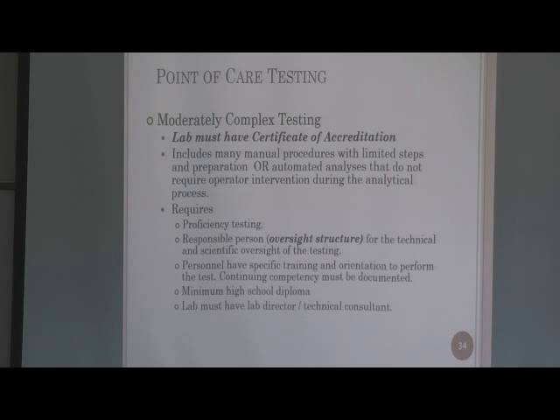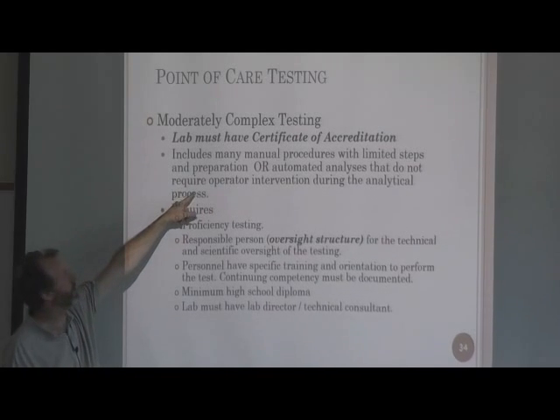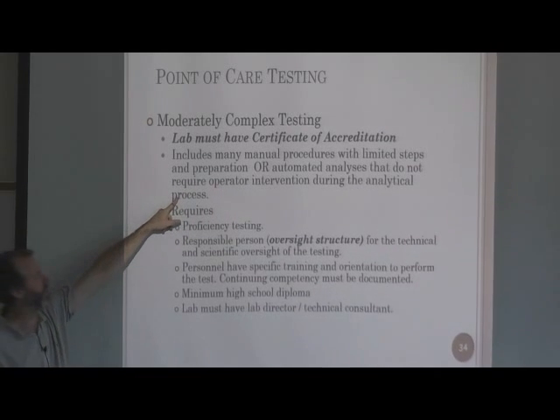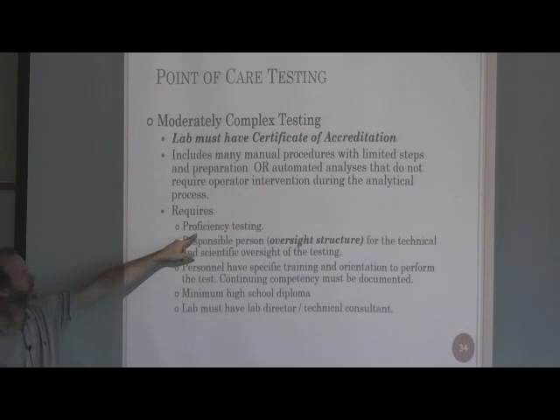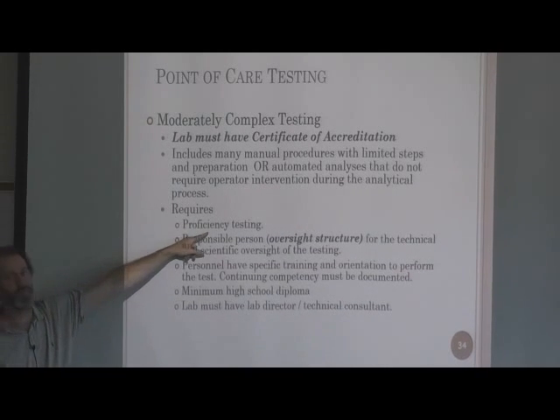So, moderately complex: the lab has to have a certificate of accreditation. It includes many manual procedures with limited steps in preparation, or automated analysis that does not require operator intervention during the analytical process. To get the accreditation requires proficiency testing.